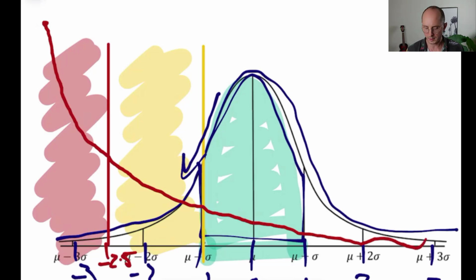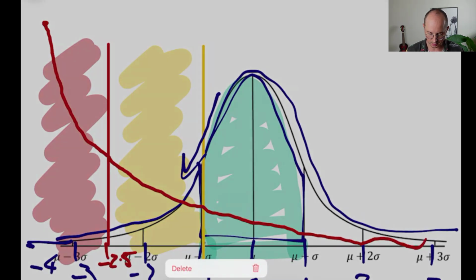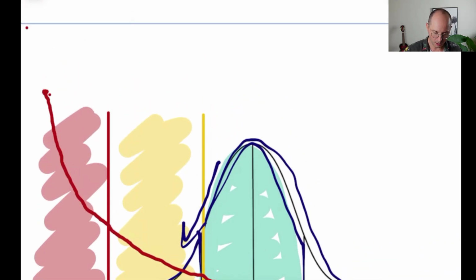So if you've got a -4, your T-score is going to be out here somewhere, right? -4, if that line were to extend. So that means that your risk of a fracture will be quite high all the way up here. Now, I'm not saying this to frighten anyone, but just to explain the significance of what's going on and that you need to do something about it.